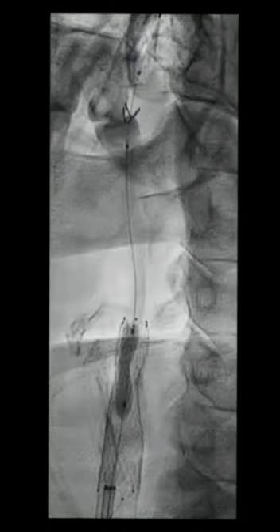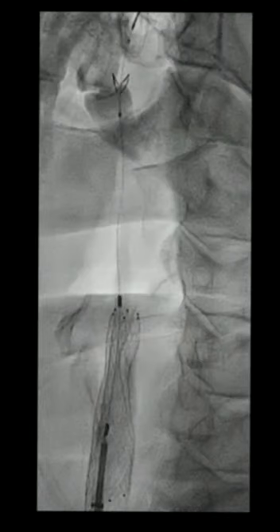You notice the microwire going across the stenotic site, following which we deploy a filter distally and do a balloon angioplasty proximally. Thereafter, a self-expanding stent was deployed, following which a 5 mm balloon angioplasty was performed to achieve better wall apposition.